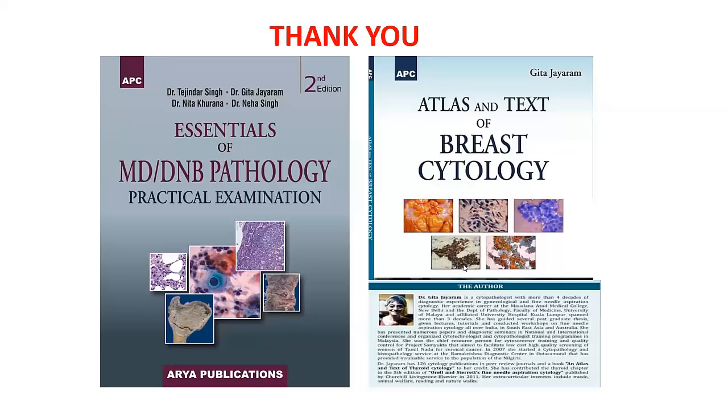Dr. Shiny asks, which marker, CD71 or E-cadherin, is good as IHC for identification of erythrocyte precursors? See, for pure red cell aplasia, CD71 is a marker, not E-cadherin. E-cadherin is a marker for proerythroblast for diagnosis of pure erythroid leukemia.